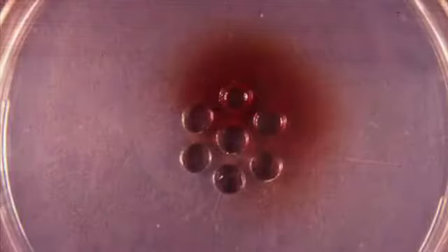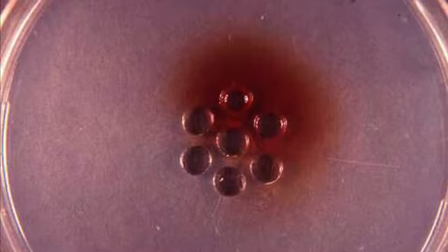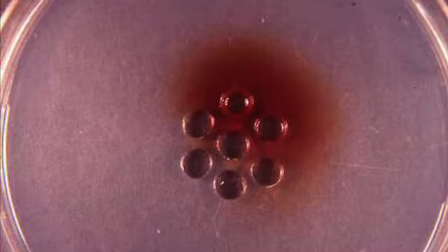A more efficient and certainly more elegant way is to take a petri dish. Into the petri dish, which I show here, you put a layer of agar, very precise agar called agarose, and then you punch holes in the agar, and into the holes you put your antiserum and antibody and antigen.